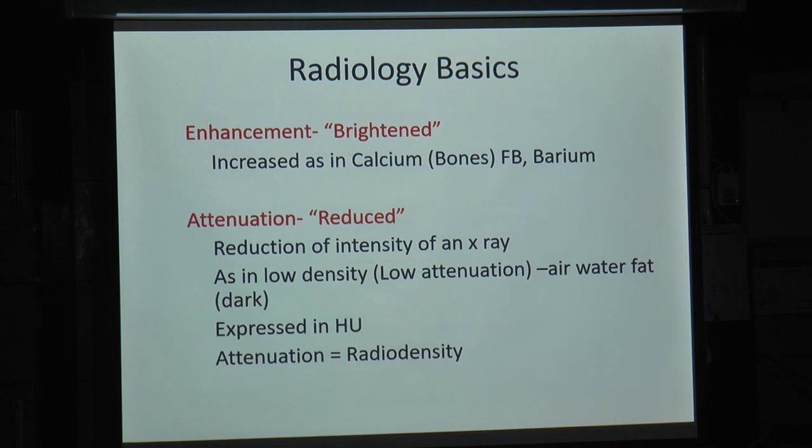Enhancement. Now, if you look up the word enhancement, the English word means brightened. So you have the photo gallery in your phone. You try to pep up the contrast, put some sharpness, some brightness, pep up the picture. You can do this digitally, but you can also do it to the image as well. So anything that enhances the mass after a dye is an enhancing SOL. And enhancing SOLs can be subdivided into a variety of categories which I'll go into later on.